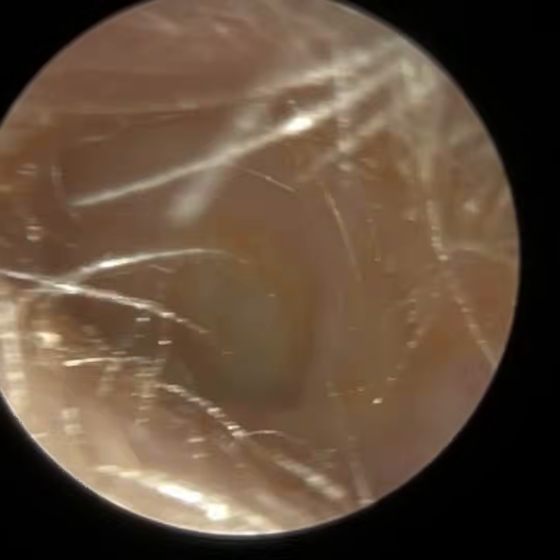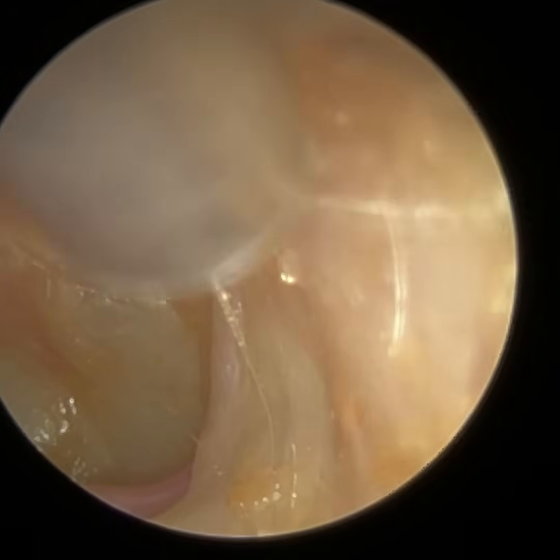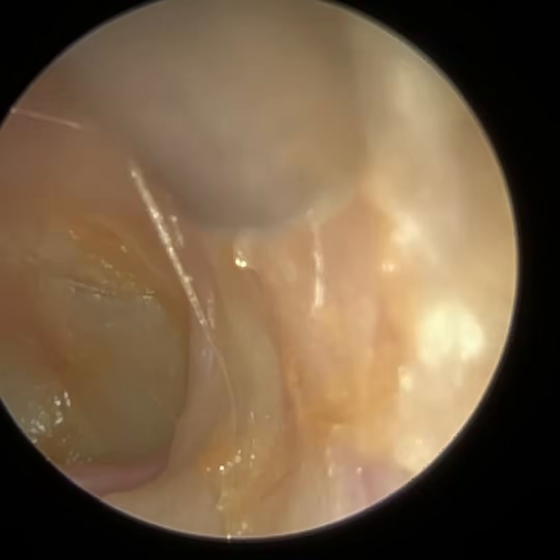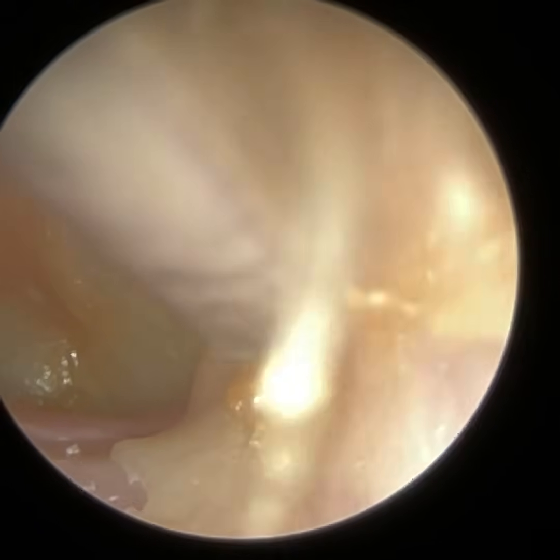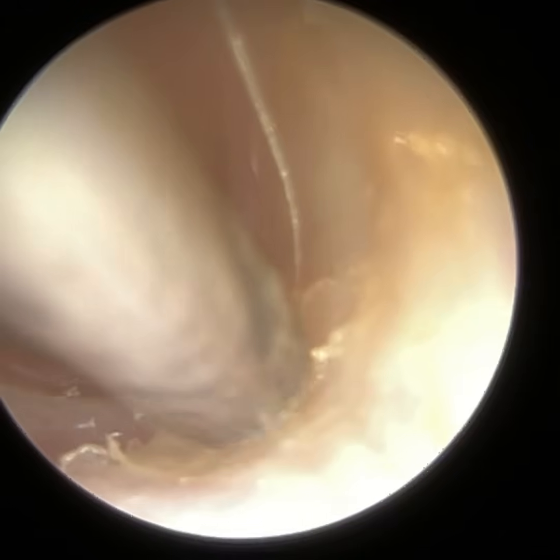And essentially, this patient's epidermis layer of skin has failed to migrate, it's died, and it's shed, and there's multiple layers like an onion, sitting on top of each other. And even at this stage, the patient's hearing significantly better. There is going to be some residual skin, the thinnest layer of skin, that attempted to peel away, but then the patient experienced the caloric effect.